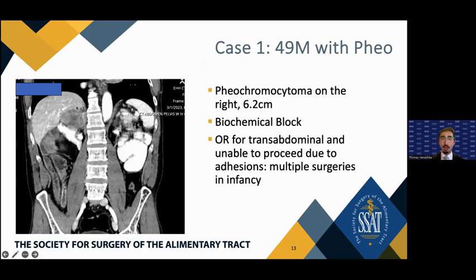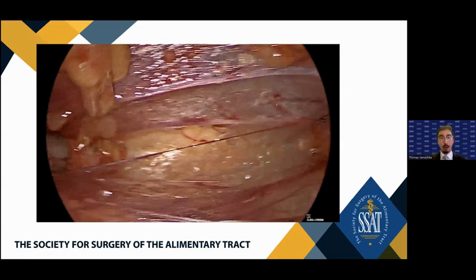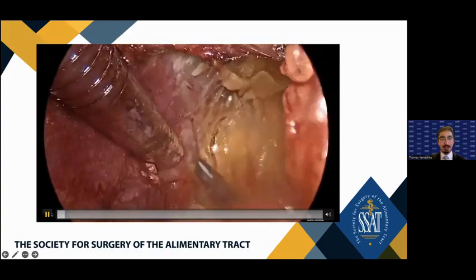So we can see a very large tumor on the scan, pretty superior, pretty medial there. I'm going to start on the video here. I apologize, it's a little fast just because I want to get a couple of points. Before I play the video, this is already Gerota's being spread out and open. So you can see the fibers and underneath the fat showing up, and there's a lot of blunt dissection happening.